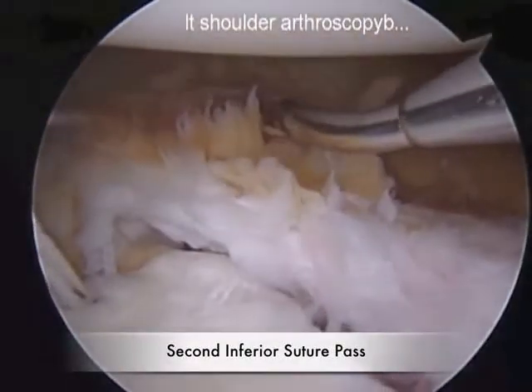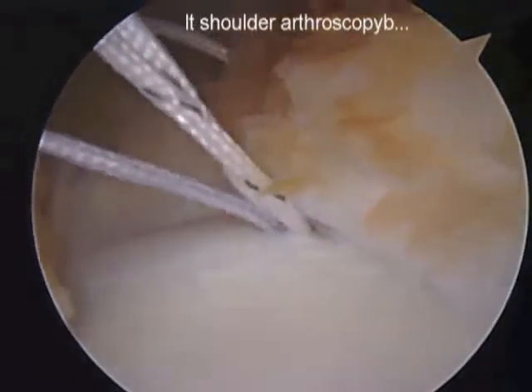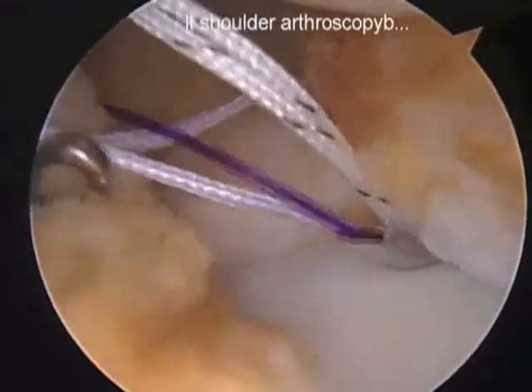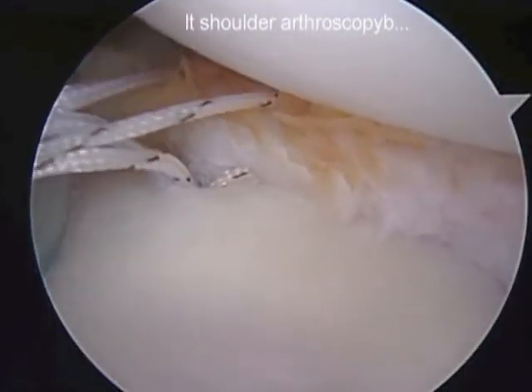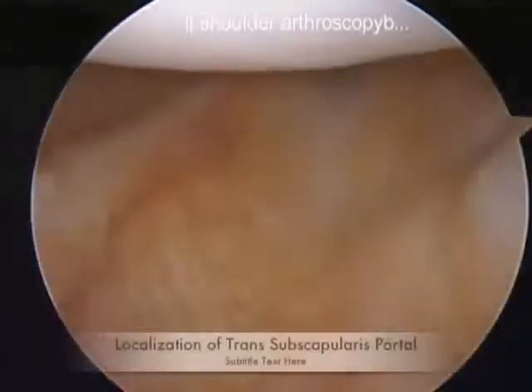The second suture pass is taken from the anterior-inferior portal. This pass will continue to reduce the anterior-inferior capsule and shift the tissue superiorly and laterally. Here you see the two stitches passed in a simple fashion. These are left untied so as not to impede the mobilization of the bony fragment.